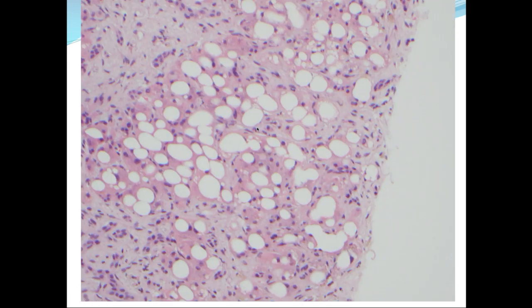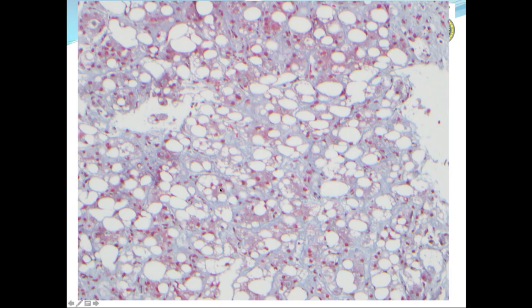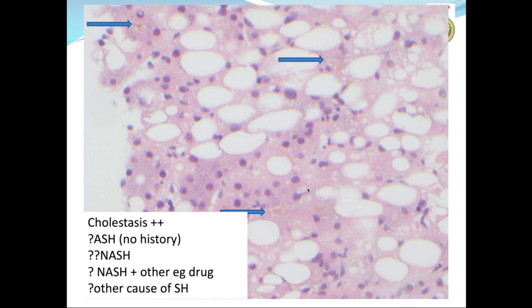As I said, you can see the fibrosis on H and E. This trichrome's a little pale, but again, I think you can appreciate that there's really quite marked zone 3 pericellular fibrosis. And another feature was some quite marked cholestasis.